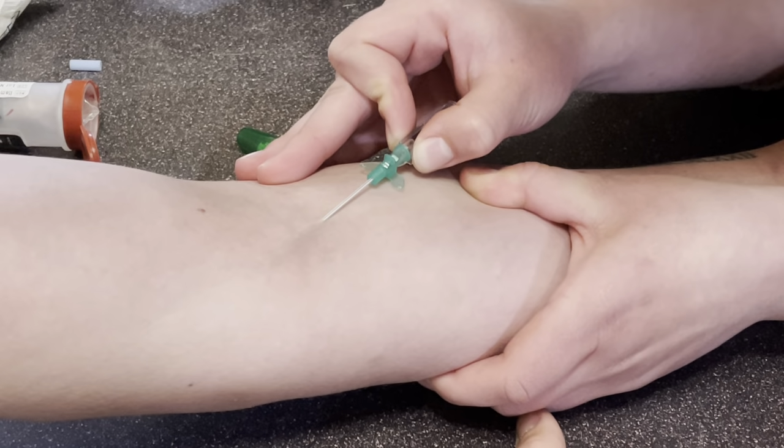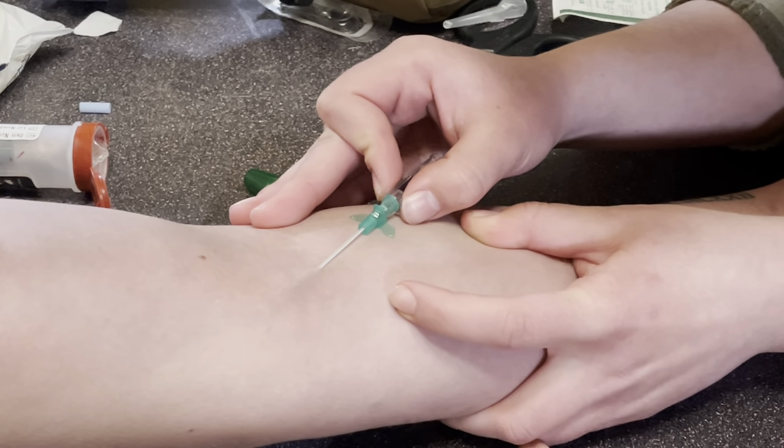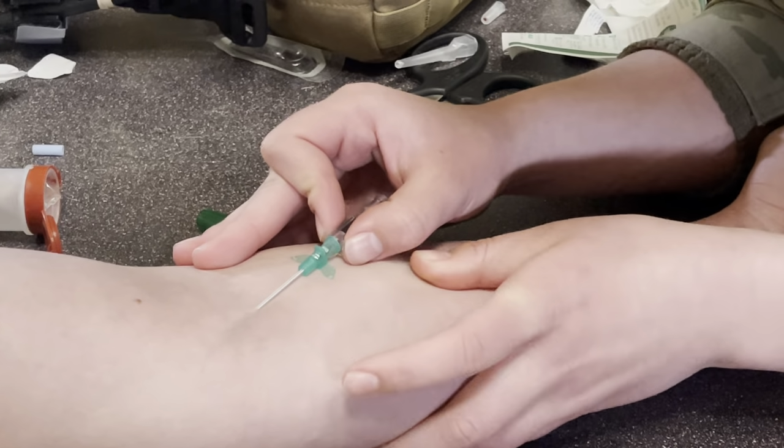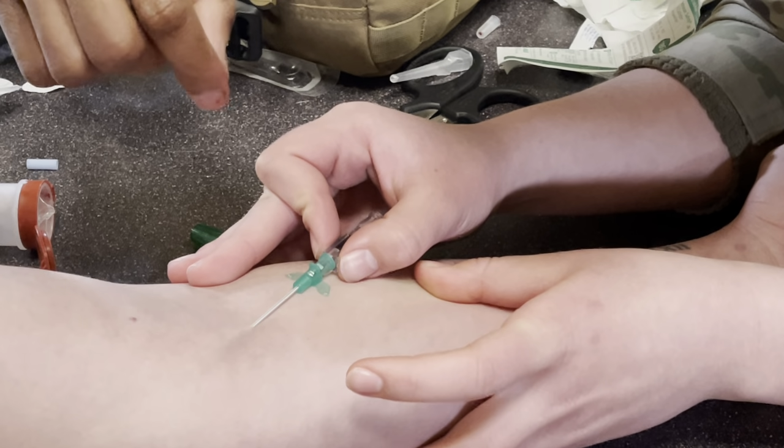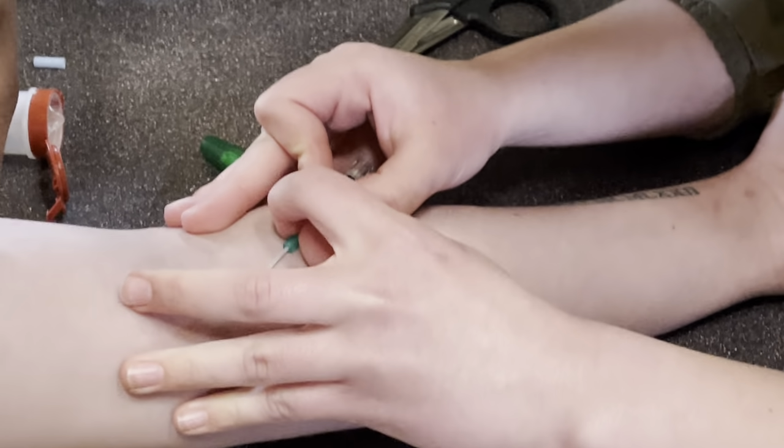All right, so you got it? So we're going to drop it a little bit. Okay. Go a little bit further in. All right, that's good. So then just advance the catheter part. Can I let go of his skin? With this hand, so move that forward. There you go. Take this off.